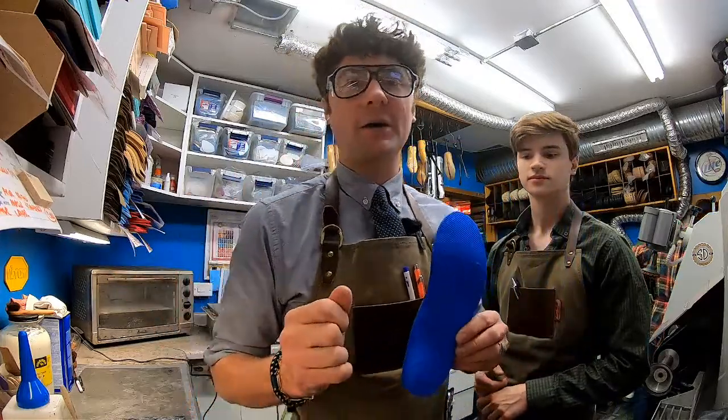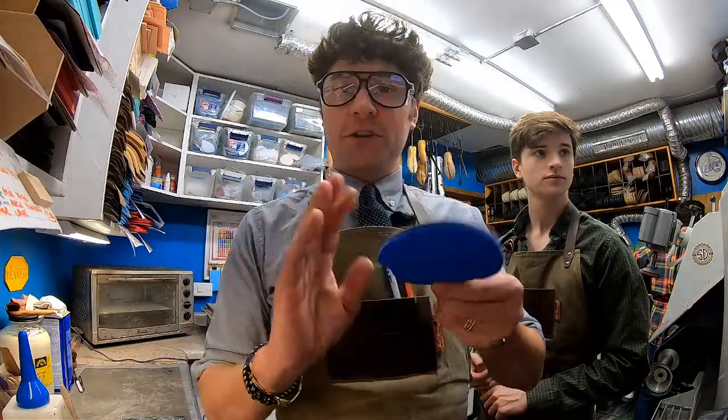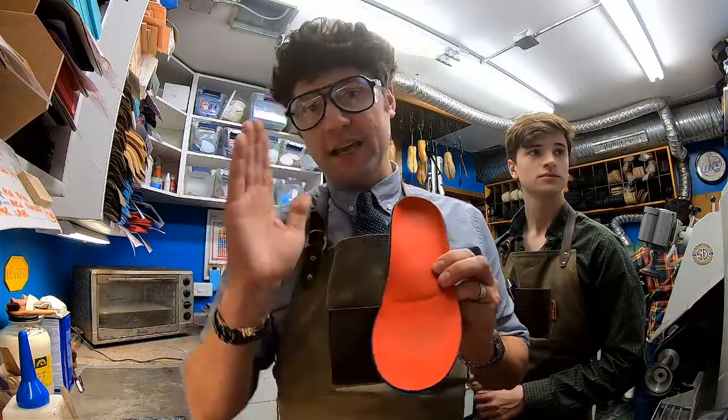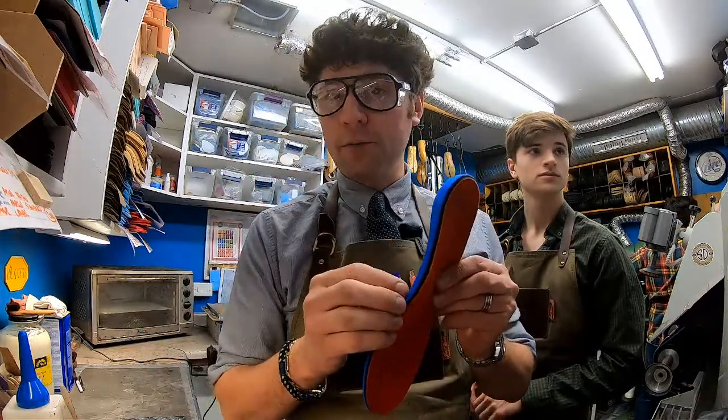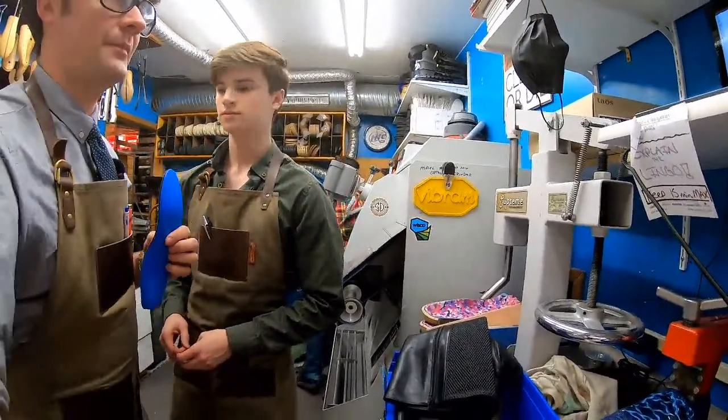Like in one of the last Workshop Lives, I said we want to respect the longitudinal arch. So we're trying to shift some of that pressure more into the center line of the foot, take it off the inside without totally removing that. We're going to still level that off. So first step, we're going to fix this up.